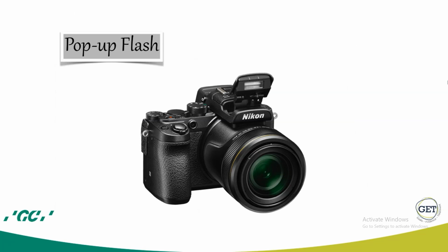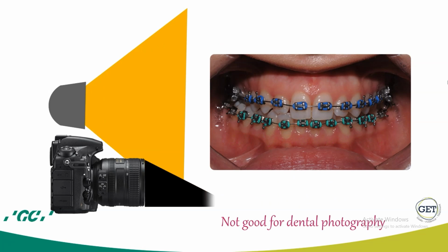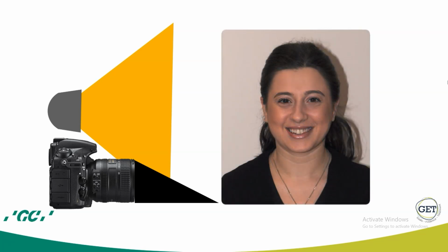Almost every camera has a pop-up flash. Basically, it's the own flash of your camera. A pop-up flash is located on top of a camera, and when used with macro lens, you create hard shadows in your intraoral pictures. They are not good for intraoral photographs. It's the same for extraorals. You see, it creates big amount of shadow under the neck. Or if you hold the camera rotated to one side, you will have shadows on the other side of the patient.